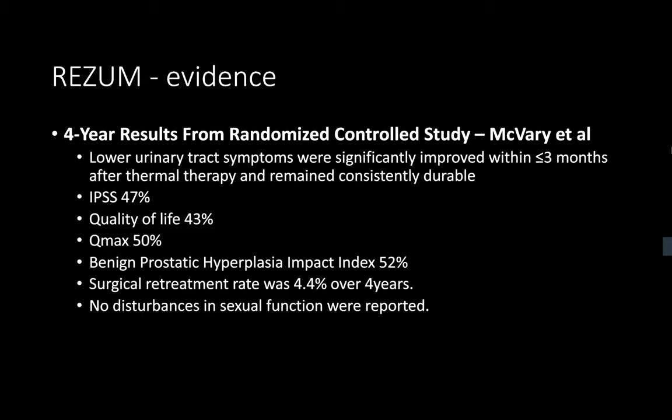the prostate. The procedure initially may be offered under general anesthesia, however, with growing confidence in the surgeon and the team, it can be done under local anesthesia with or without sedation. All patients will need a catheter for at least 3 to 5 days, depending on the size of the prostate. It is contraindicated in patients who have a penile implant or urinary implants because of the concern about the high temperature.